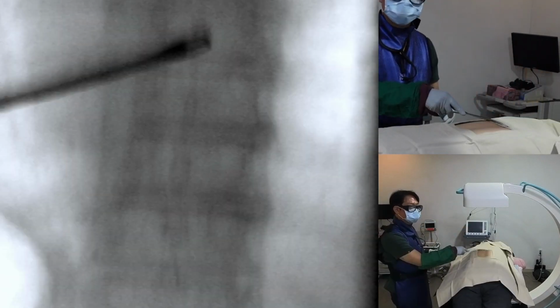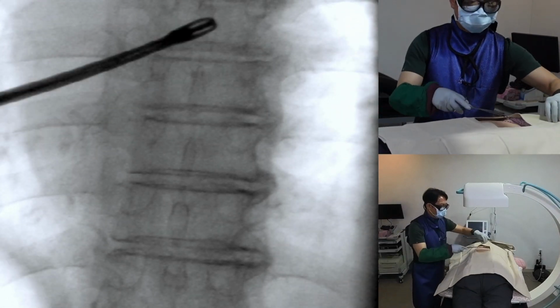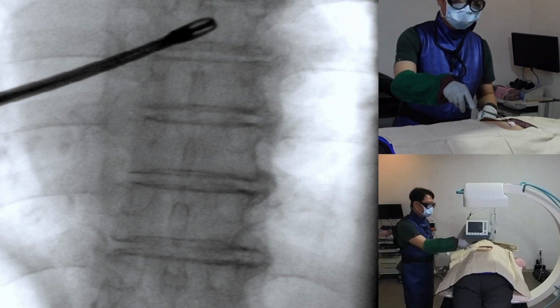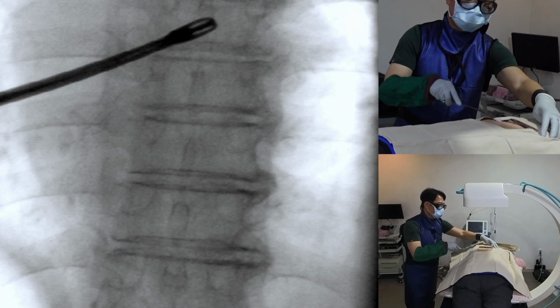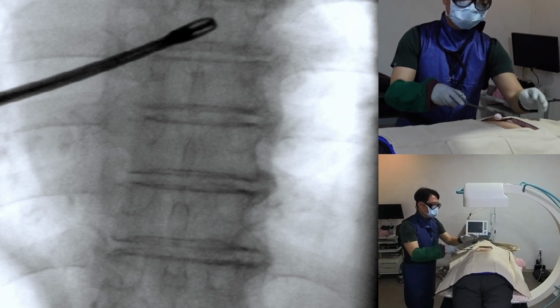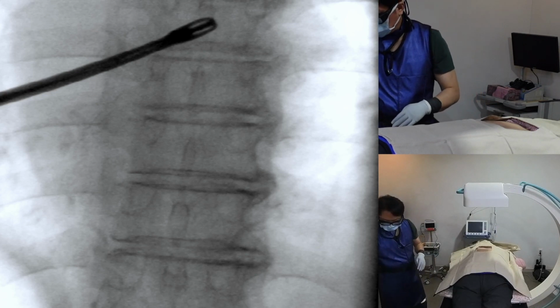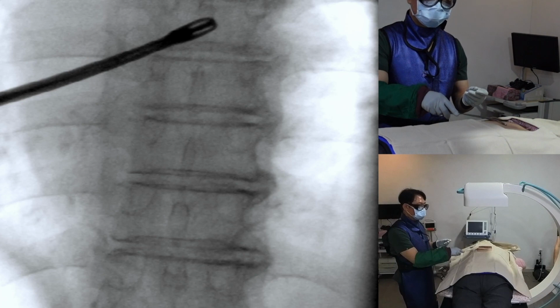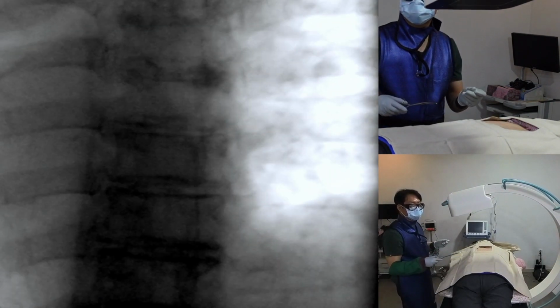Once I have identified the target level, I tilt the C-arm to find the endplate line of that level. Usually, I tilt the C-arm in the upper thoracic spine cranially and lower thoracic spine caudally to align the endplate. The tilting angulation degree depends on the deformity of the patients, as many patients show multiple compression fractures and deformities in the older age group. And then, I turn the C-arm to the ipsilateral oblique image.